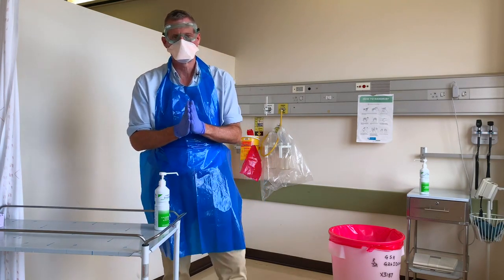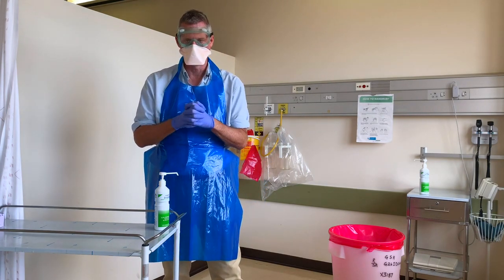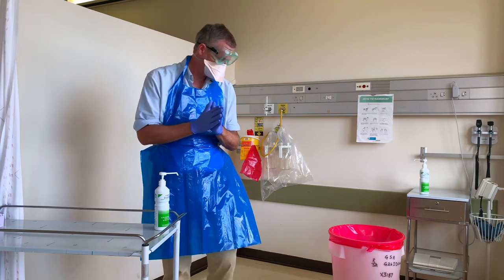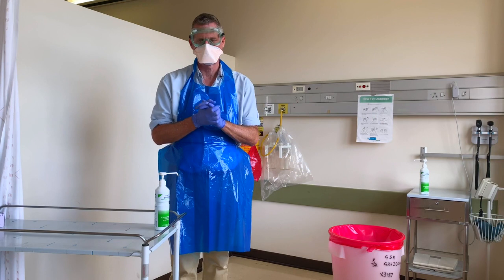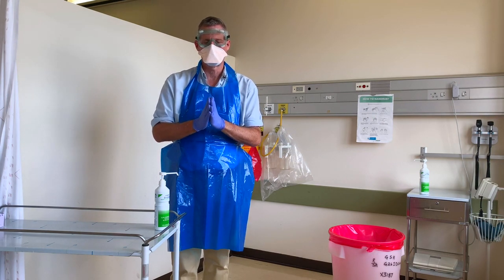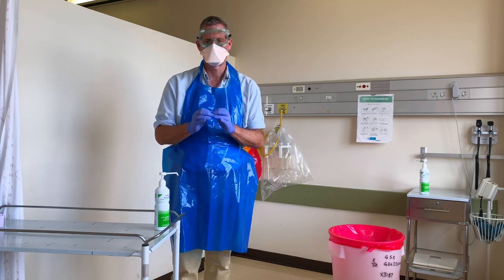I'm now going to show you how to take off this equipment safely. For this you're going to need an appropriate bin to place the waste, and again you want to be sure that you're doing this in a slow, controlled manner.